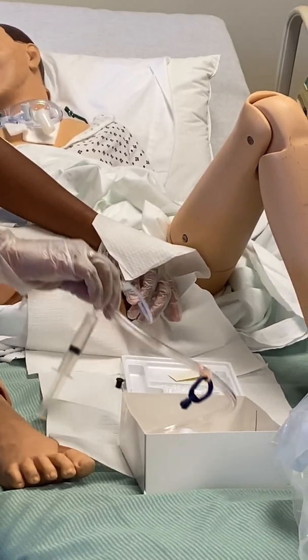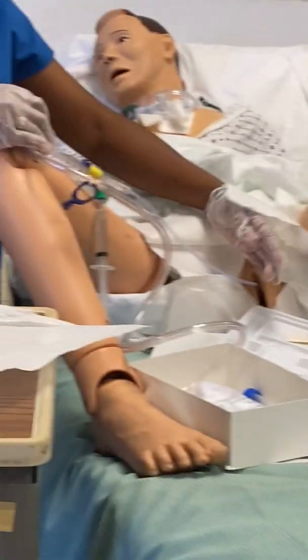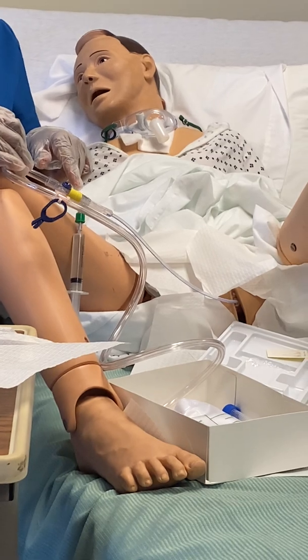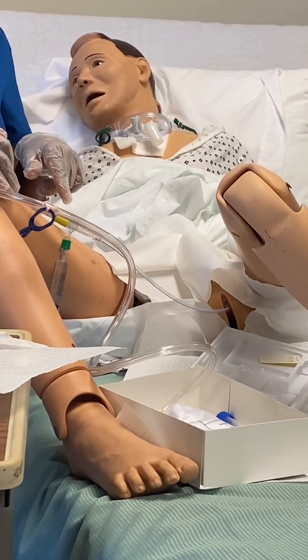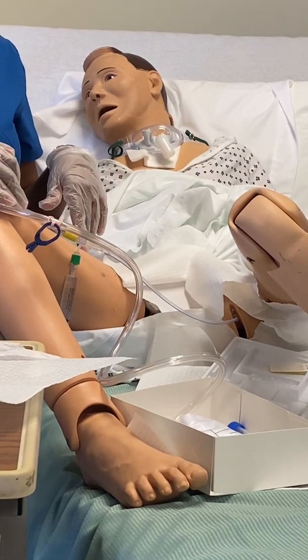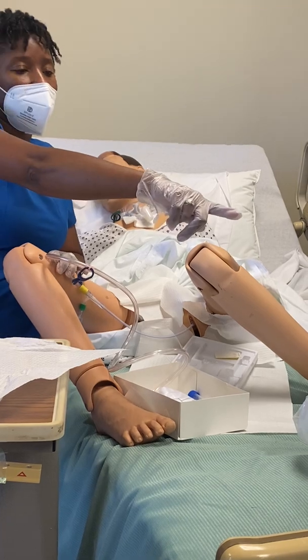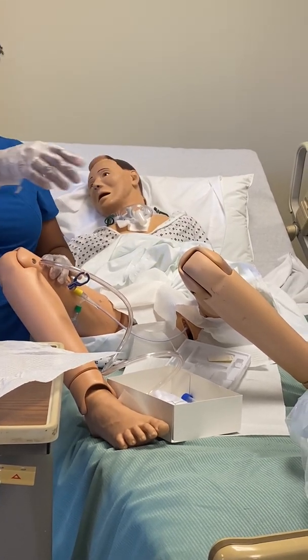So I'm going to take this, and I'm going to tape it to the leg. And remember I told you somewhere else you can see that, 5 ml. It's right there on the counter, okay? I don't care about that leg because my sterile procedure is over now, thank God. Okay, so don't freak out as a student. I'm going to tape it to that leg.